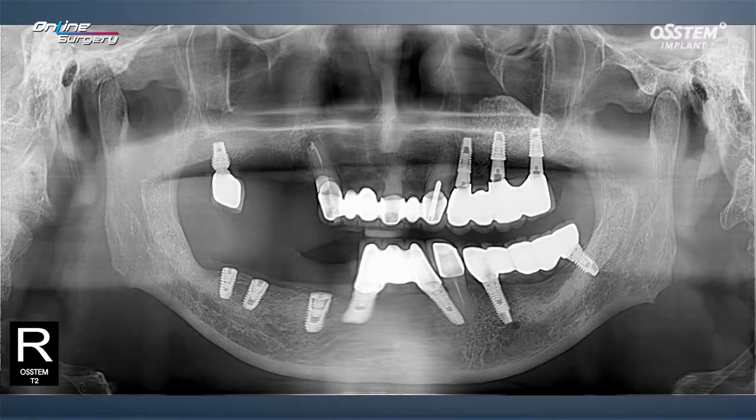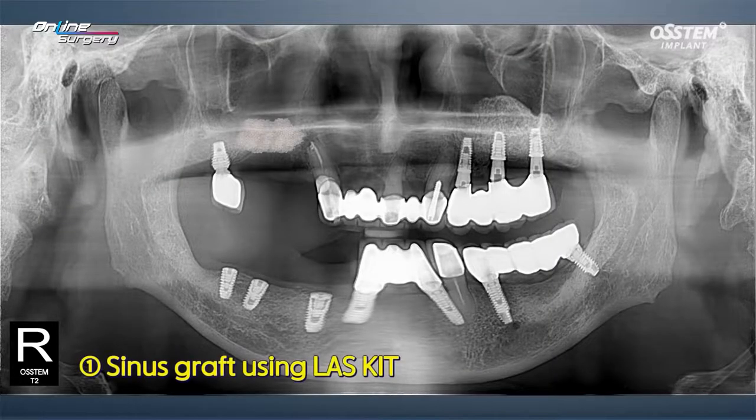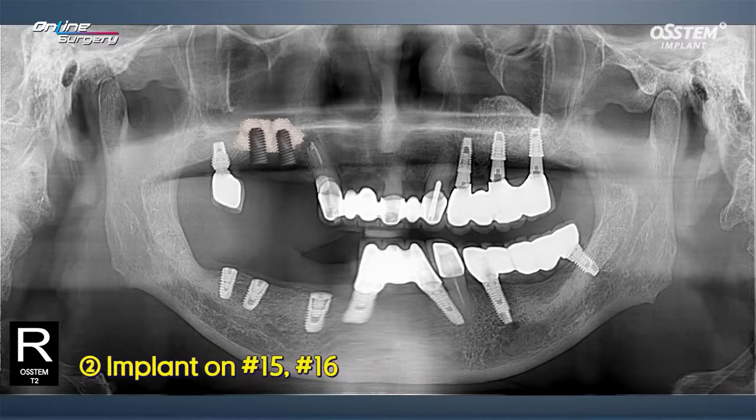Bone graft was done. LASKIT was used, sinus approach was done, and two implants were placed. This was the plan.